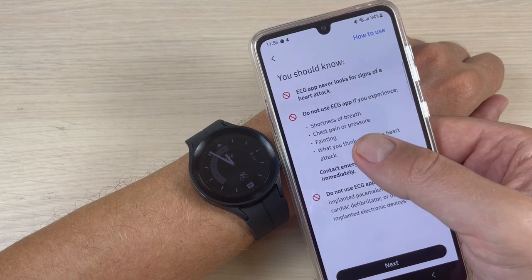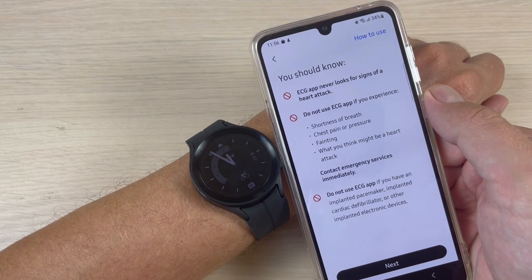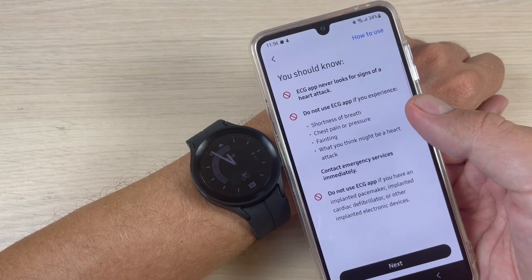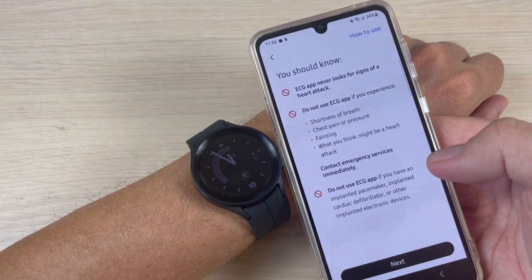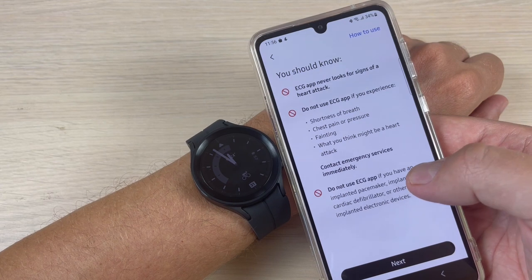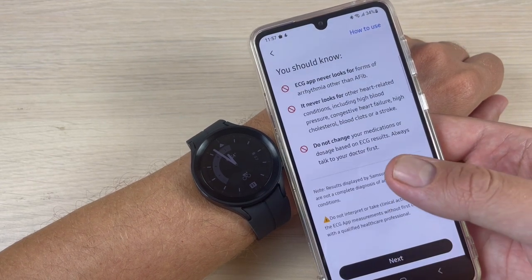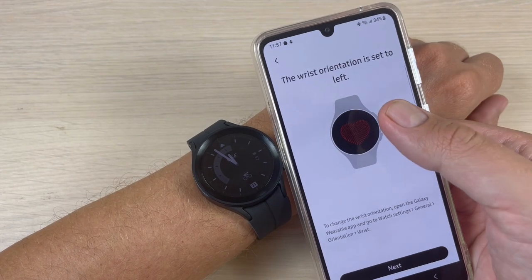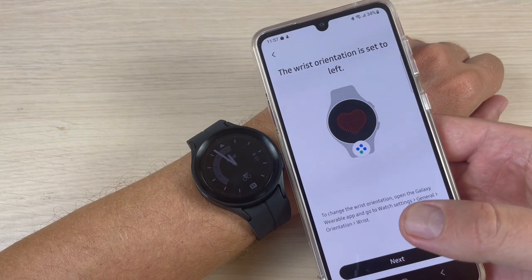Do not use the ECG app if you experience shortness of breath, chest pain or pressure, fainting, or what you think might be a heart attack. Also if you have an implanted pacemaker, implanted cardiac defibrillator, or other implanted electronic devices. Now just press 'Next'. The wrist orientation is set to left. Press 'Next' again.